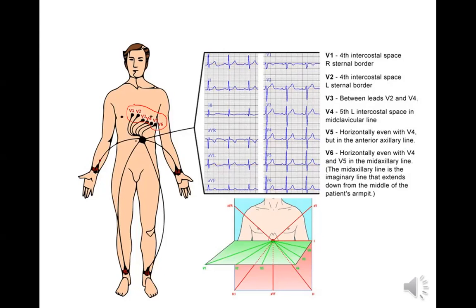Okay. And then this is standard because it's actually on the limbs. Modified, we put up here at the midclavicular line, second intercostal space for the upper limb leads, and down here, inferior medial to the anterior superior iliac spine. Okay, so this guy has a standard 12 lead EKG electrode placement on it. And here's his results. So what do we look at first?